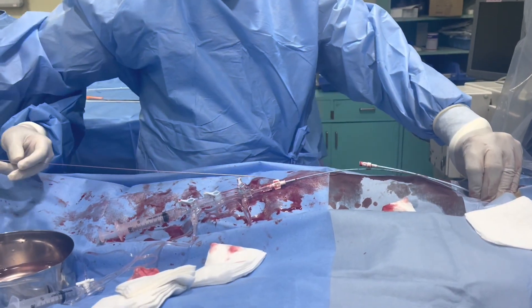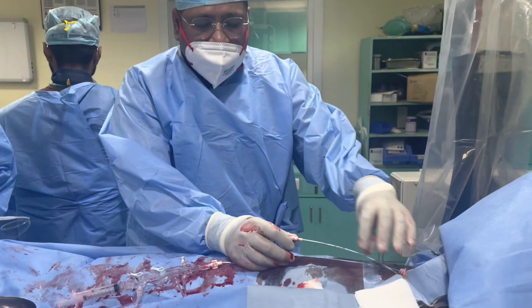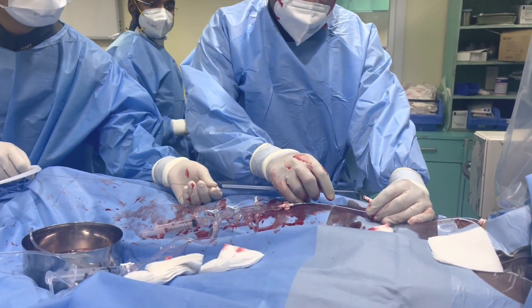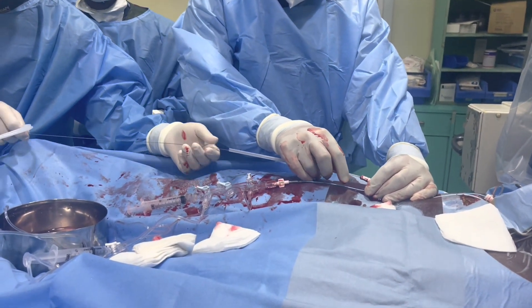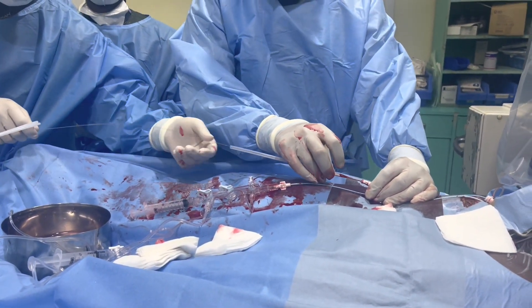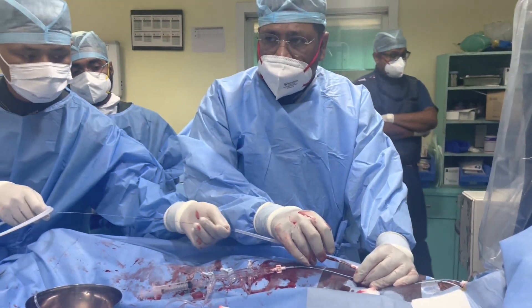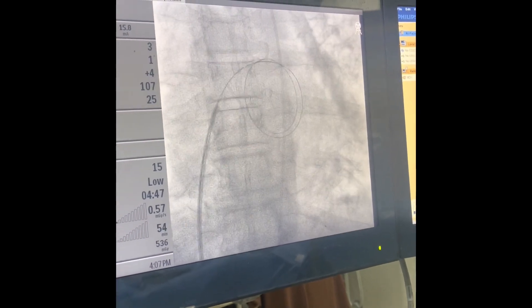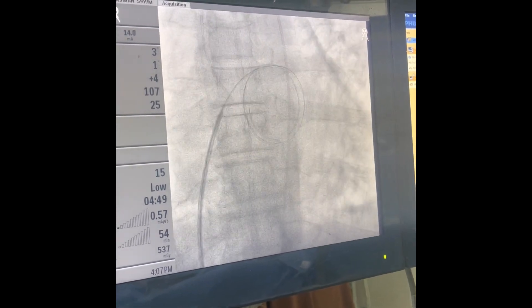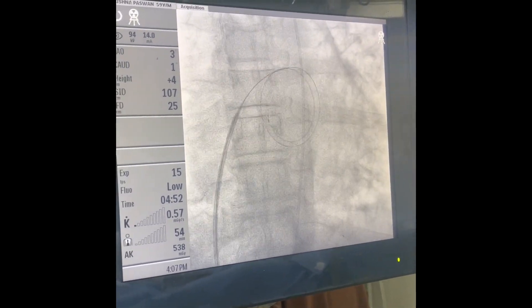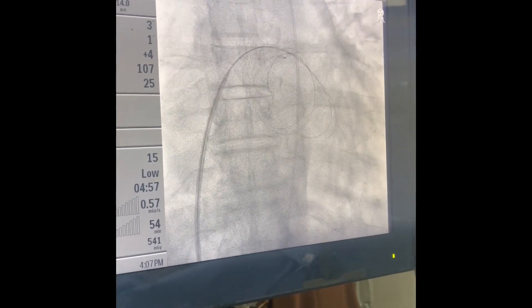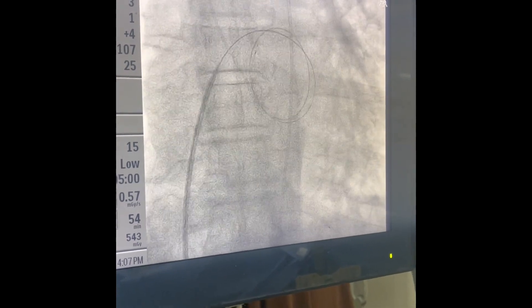Two and a half thousand of heparin has already been given here, so half of the heparin needs to be given early before the procedure. Just advance it. Now we are taking the LA wire — the LA wire is inside. Now we give the remaining heparin — we've given two and a half to three thousand, so give two thousand more.